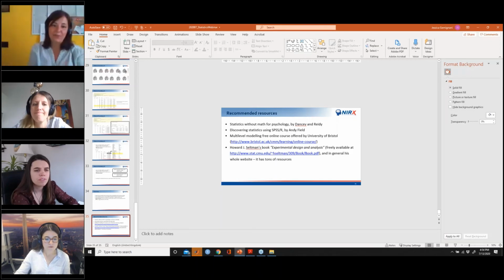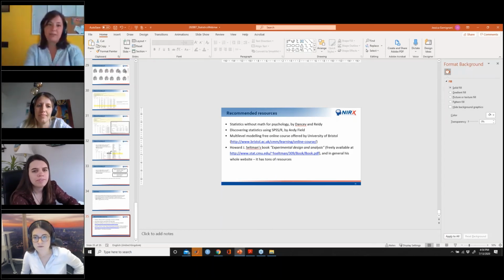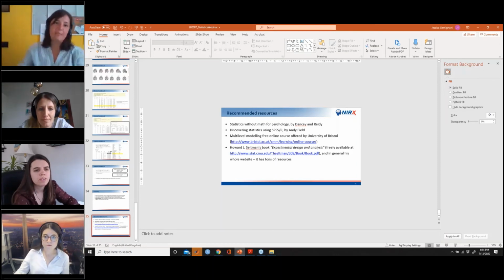You cannot place something that was measured in a different moment. You need to place something that was measured exactly at the same time as the measurement. If for technical reasons it is of different length, you can trim some part of the longer time series as long as you don't cut a stimulus. And even if you cut a stimulus, you have to adjust the length.